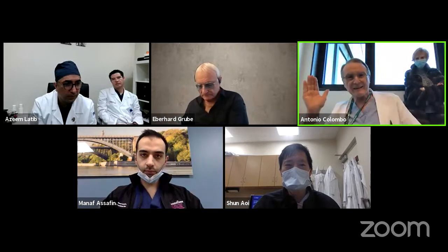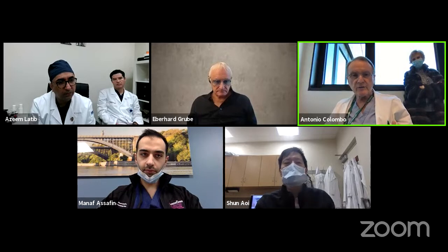Yeah. Changing the position of the guiding catheter is very important. Amazing. Sometimes you can get a stent or a device in by pulling out the guiding catheter, not pushing in, and the device goes in more physiologically. Sometimes friction can be reduced by injecting dye forcefully while you advance, or while you try to advance, pull back the wire a little bit.